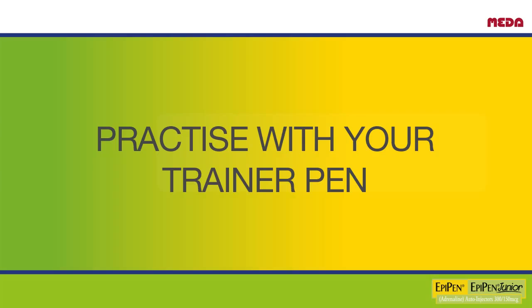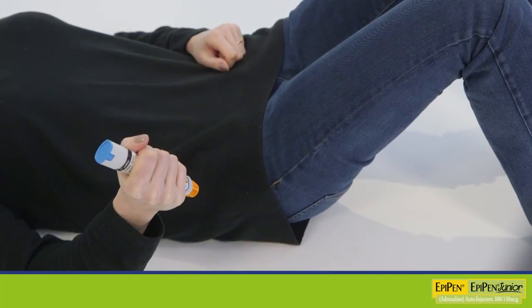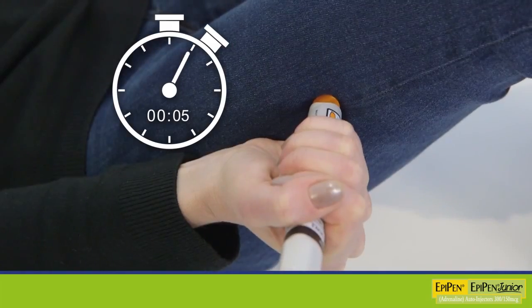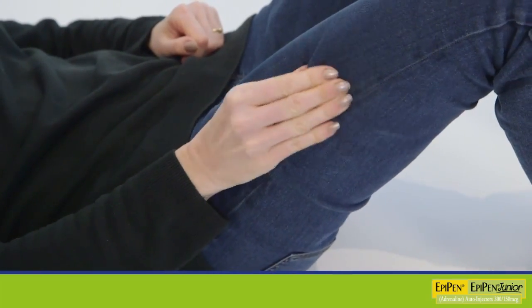The trainer pen works in the same way as the real EpiPen, but does not contain a needle or medicine. The trainer pen looks slightly different: its label clearly states it is a training device, and the label is light blue in colour, while the EpiPen is yellow and EpiPen Junior is green. To use your trainer pen, pull out the blue safety cap, jab the orange tip firmly into the outer thigh, and hold in place for 10 seconds to simulate drug delivery. Remove the trainer pen and massage the injection site for 10 seconds.